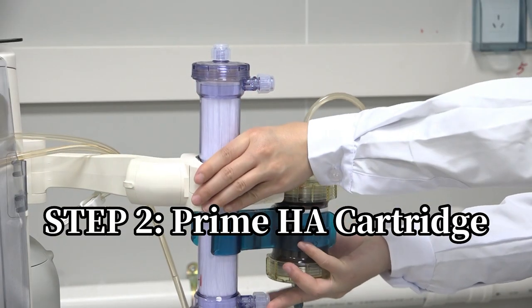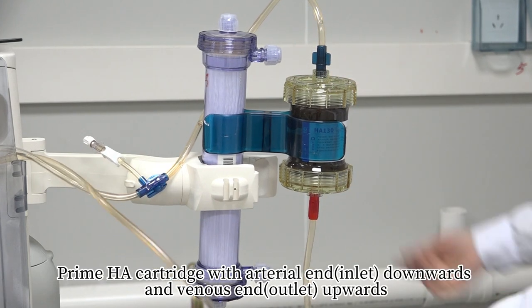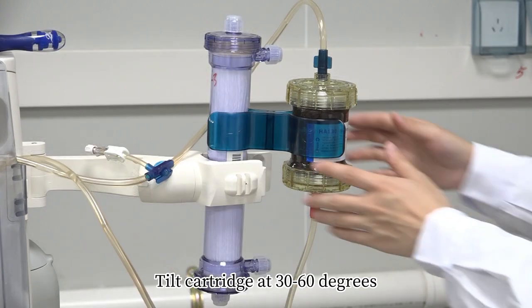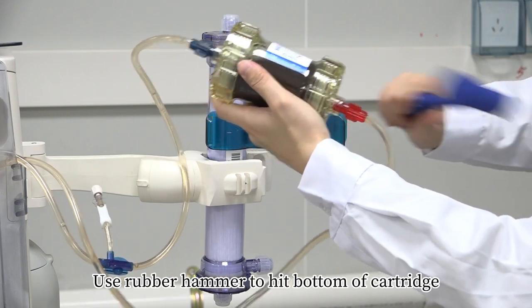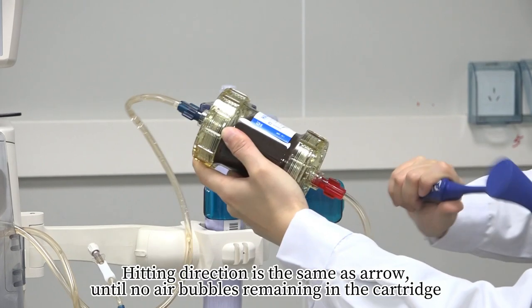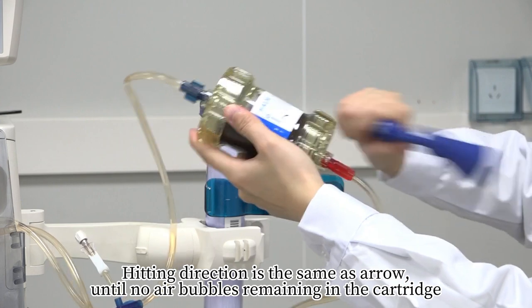Step 2 – Prime HA Cartridge: Start blood pump. Prime HA cartridge with arterial end downwards and venous end upwards. Tilt the cartridge at 30 to 60 degrees and use a rubber hammer to hit the bottom of the cartridge in the same direction as the arrow until no air bubbles remain.